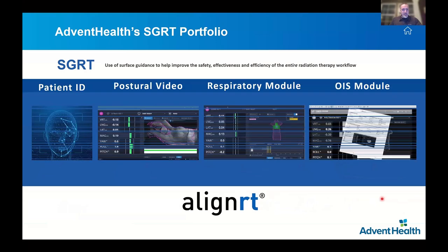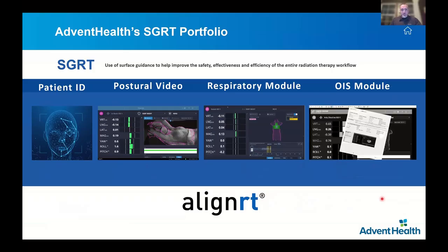But talking about AlignRT, as Josh touched on in his talk, it is a series of modules. We use the patient identification module, which is the facial recognition system that interlocks the patient's treatment to the biometric signal of the patient. We use the postural video that you saw in Josh's talk as well, on 100% of our patients. This is, I believe, one of the greatest advances in patient setups in the last 15 years of radiation therapy.